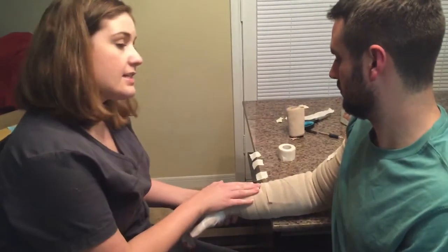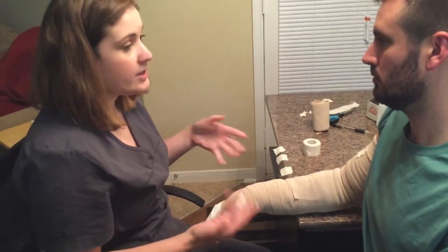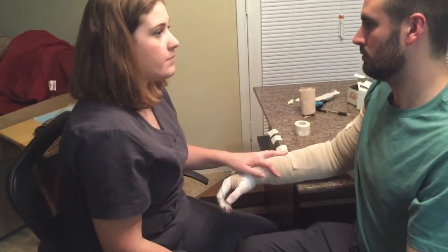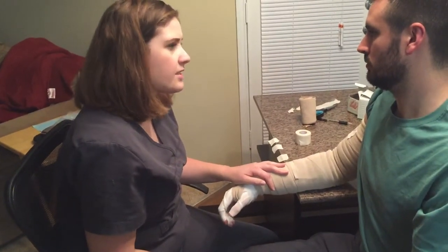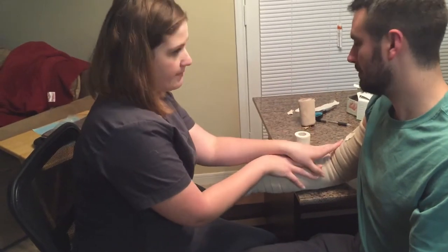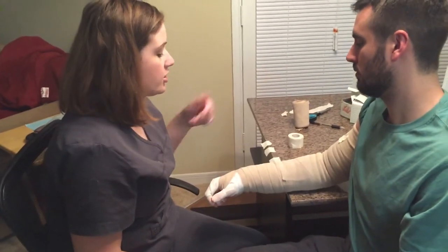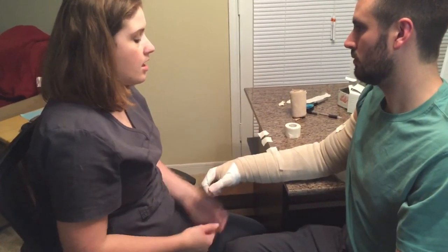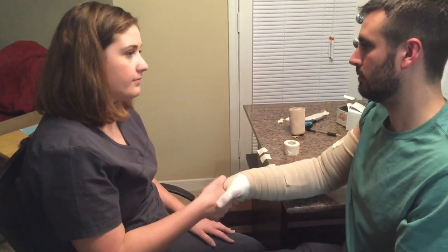Next time you come, we will reassess all this and take your limb measurements to see how much the lymphedema has decreased. Eventually what's going to happen is you're just going to get a sleeve that you flip on your arm — you won't have to do all this wrapping. Make sure you use this arm, and next week we'll go over some muscle pumping exercises to keep that lymph flow going. Do you have any questions? What about taking a shower? Just wrap it up in a plastic bag — just don't let it get wet. If you need to wash the bandage, hand wash it and lay flat to dry. If you use any lotions or soaps, just use hypoallergenic. Have a great day, and if you have any questions, just let us know.